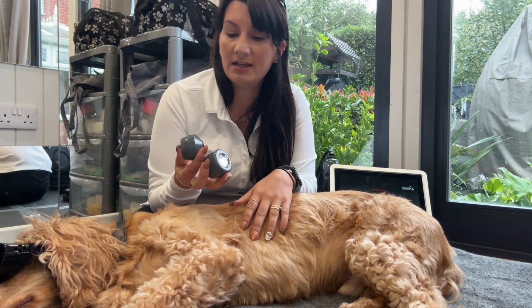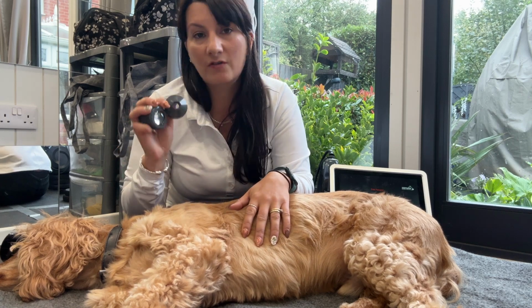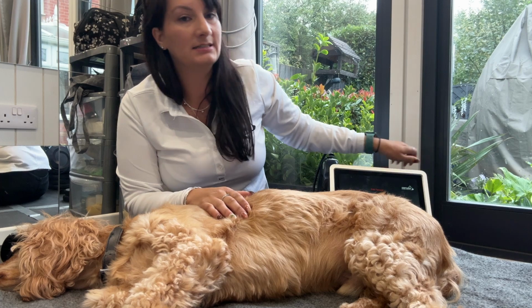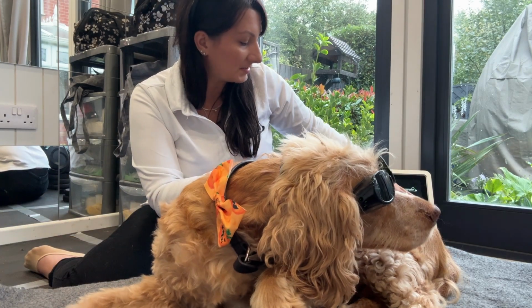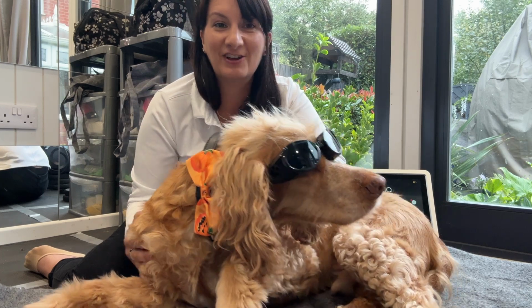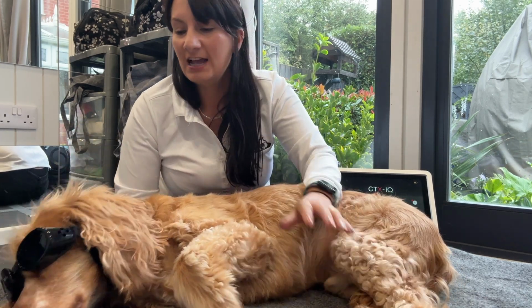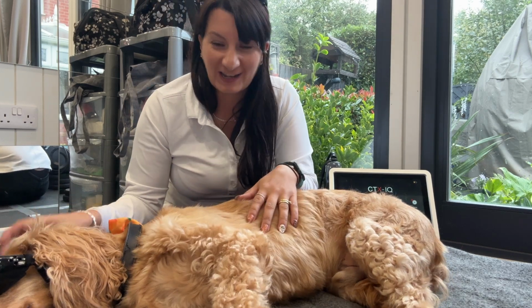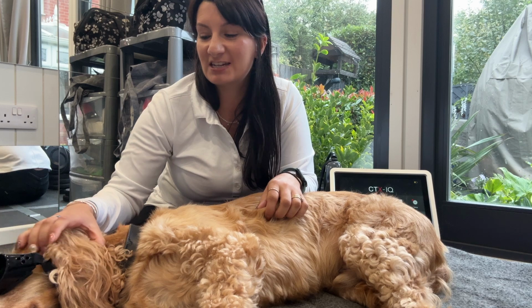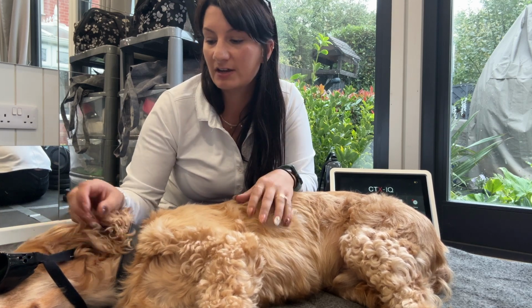And then, is it a smaller area where a smaller spot size is more convenient than a larger one? Again, going to condense that light a little bit more efficiently. So there's lots of different things that we need to think about before we even have turned that laser on to treat. And of course, health and safety, are we wearing the right eye protection, particularly if we're working near the face at all, because we do not want that risk.